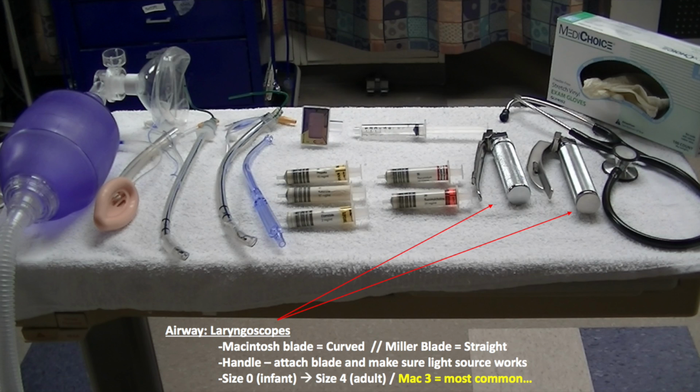When preparing your laryngoscope blades, make sure your handle and blade are connected and that your laryngoscope light source is working. Macintosh blades come in a variety of sizes. The most common is a size 3. Size 0 is for infants and size 4 is for larger adults. For most adult patients, a Macintosh 3 blade will likely allow you to adequately visualize the vocal cords.